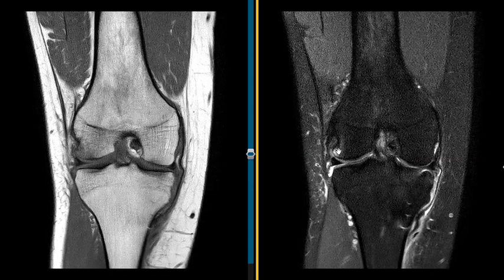Over 2 weeks, this has probably got a lot better. Just a little bit of residual marrow edema, but this MCL injury and pes anserine tendon injury is not healed yet.